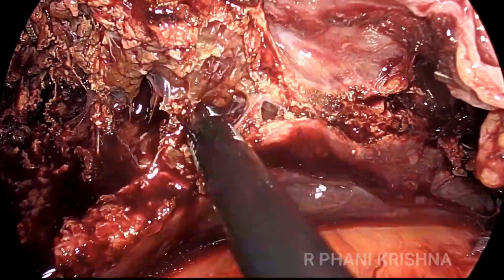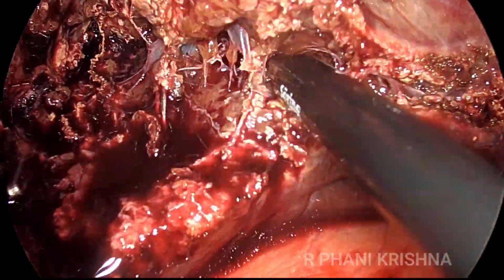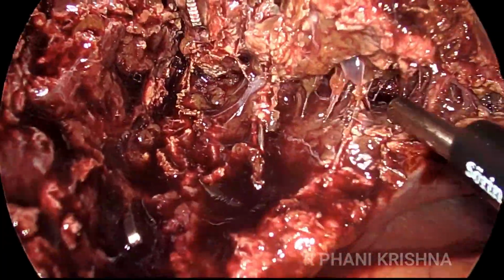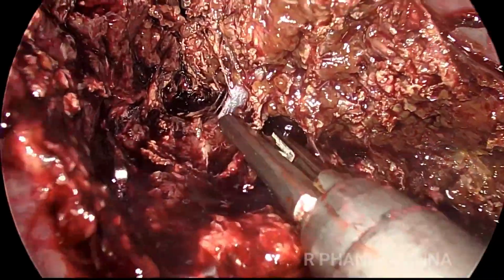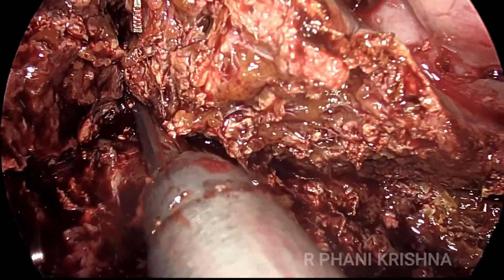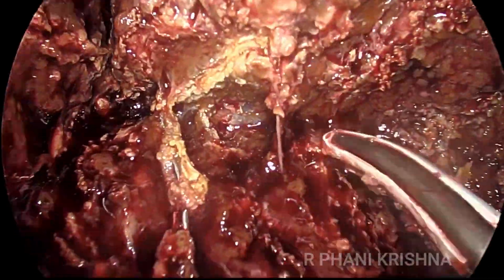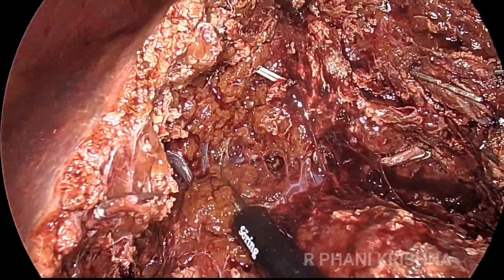So this is a very important part of the wedge, where beginners make the mistake that they go beyond the junction of the bed and the neck. Don't take your wedge onto the hilum, because once you reach there, you'll have major Glissonian pedicles, and there could be a chance of a major vascular injury or a portal vein injury.